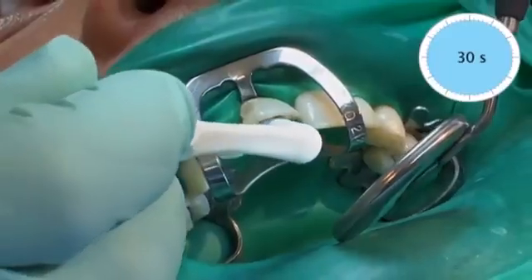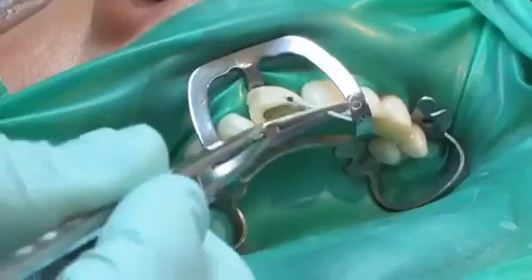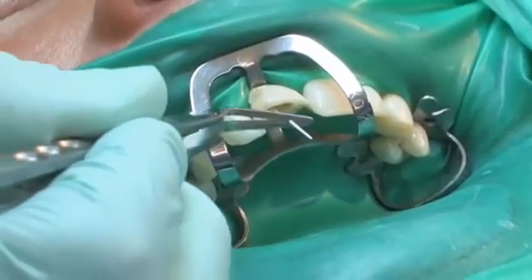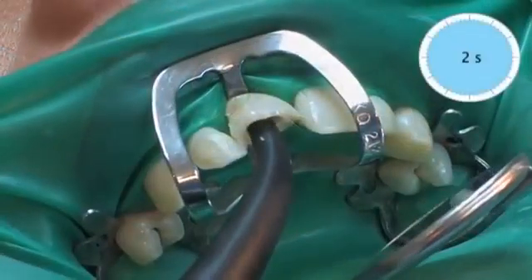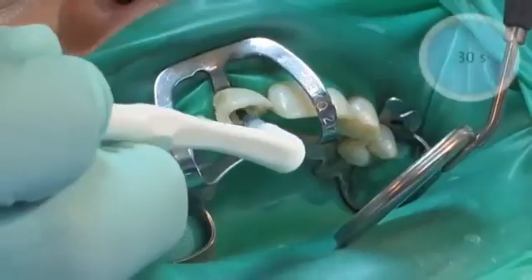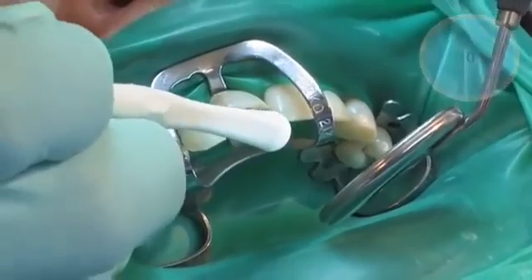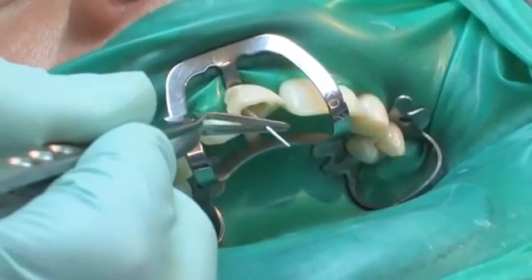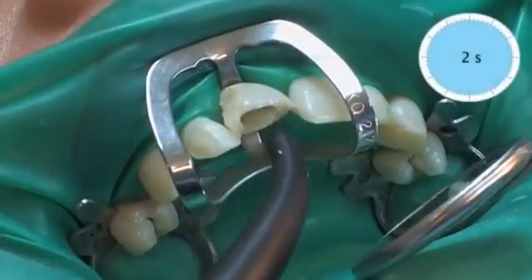Parabond non-rinsed conditioner is massaged into the root canal and onto the tooth surface. Excess conditioner is removed using a paper point and dried afterwards using a gentle stream of air. The mixed Parabond adhesive is applied directly into the root canal and onto the tooth structure. Excess adhesive is removed using a paper point and carefully dried afterwards using a gentle stream of air.